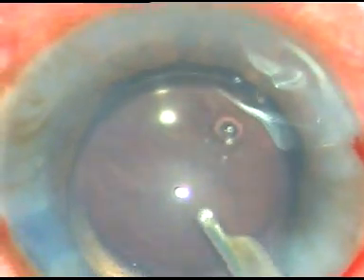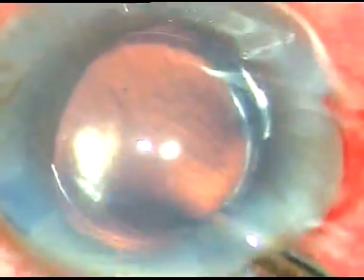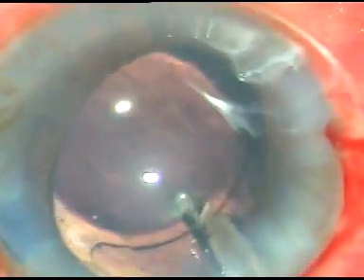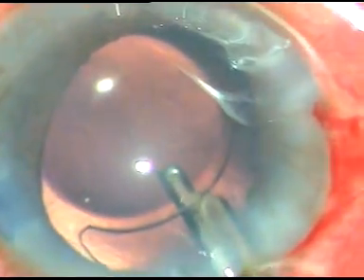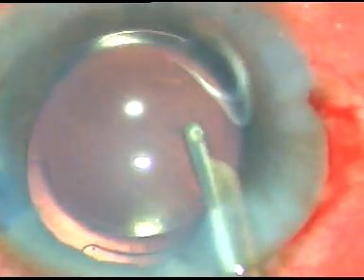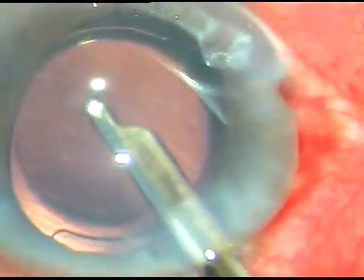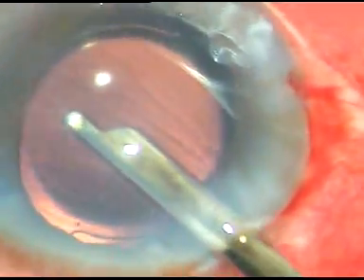There's a lot of HPMC in the antechamber and in the capsular bag. I flush the viscoelastic substance out. That's it. Viscoelastic substance has been removed nicely.